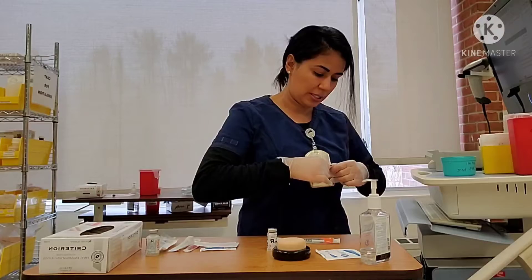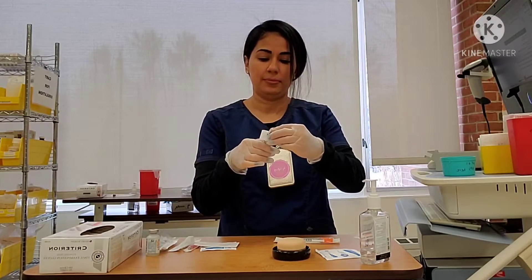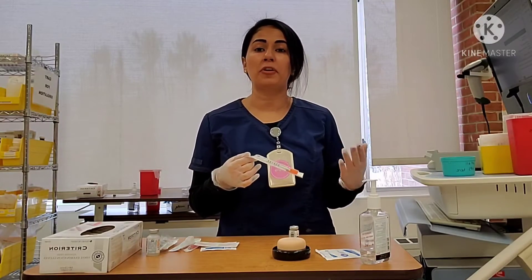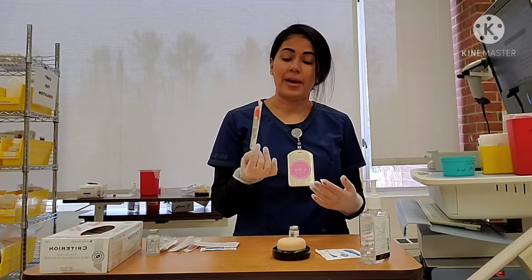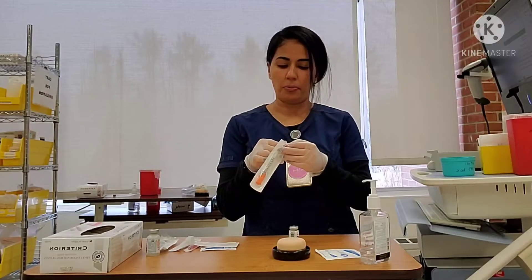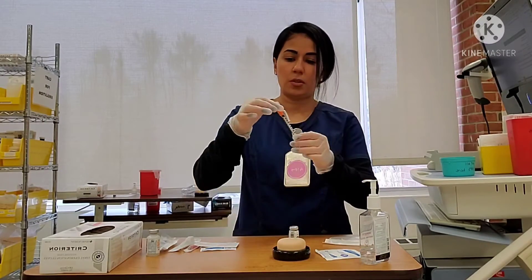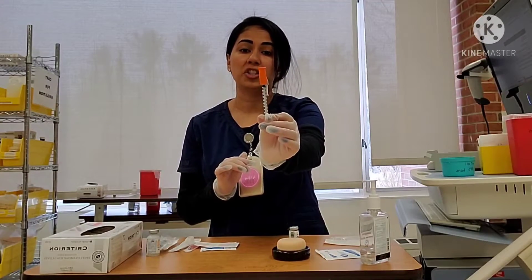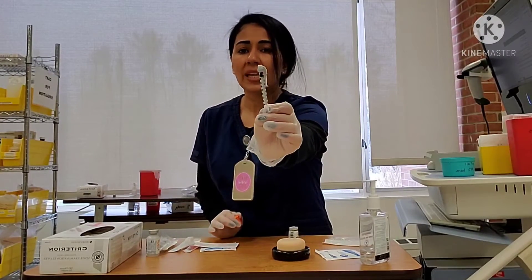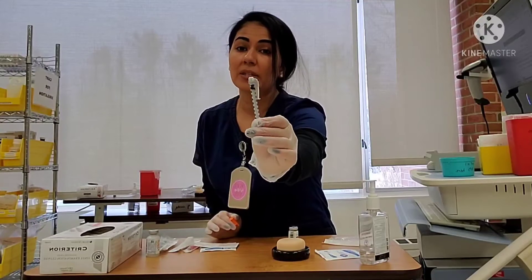So first I'm going to clean my vial. Now in a lot of injections you're going to give, you will use different needles to withdraw the medication and then to administer it. But with insulin, it is okay to use the needle that is in the syringe. Notice that my insulin syringe has an orange cap — that's a way of making sure we don't make a mistake and use the wrong syringe. There's my half-inch needle; it's very short because I'm not going into the muscle, I'm going into the subcutaneous tissue.